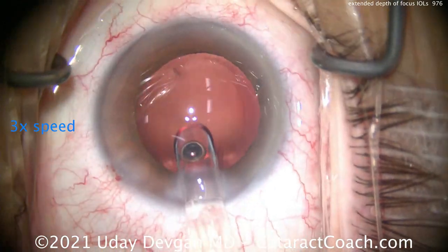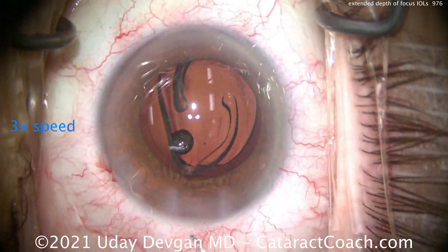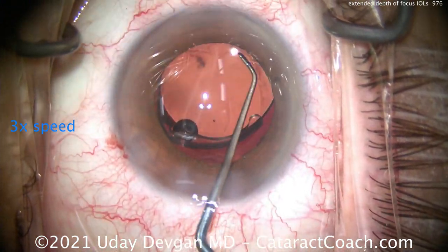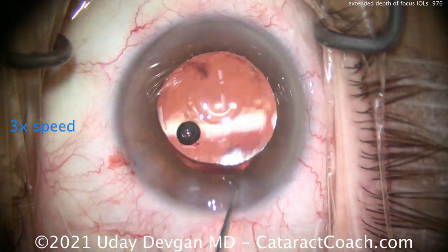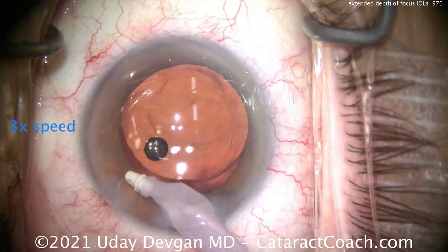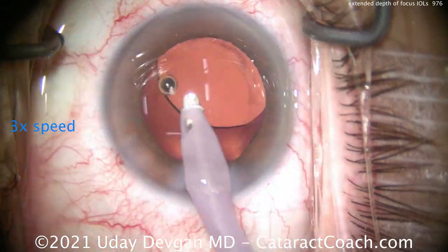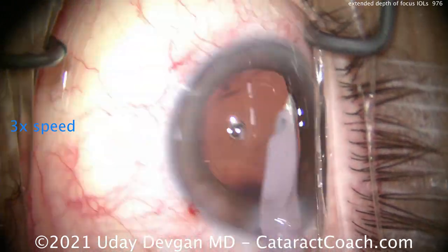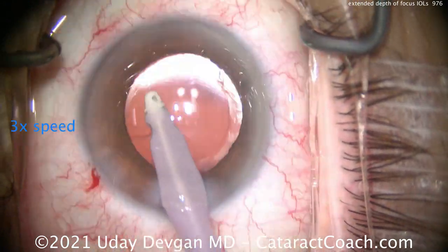Let's put that inside the eye. It's on the standard Acrosoft platform — a single-piece acrylic lens — and it's placed in the eye the same way you've been using other single-piece acrylic lenses. The key here is we have to really center up the lens. We'll go and remove all the viscoelastic, certainly from behind the lens, because we want to precisely place the center of that optical zone right in the visual axis.